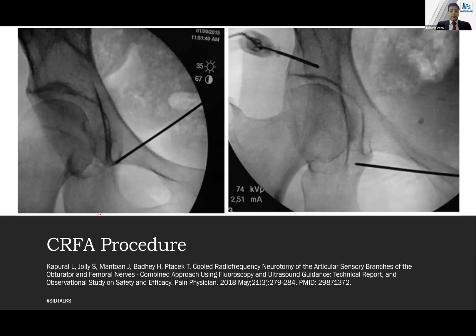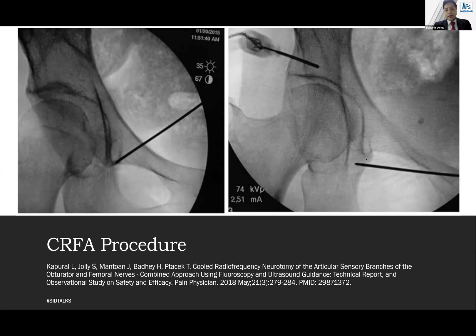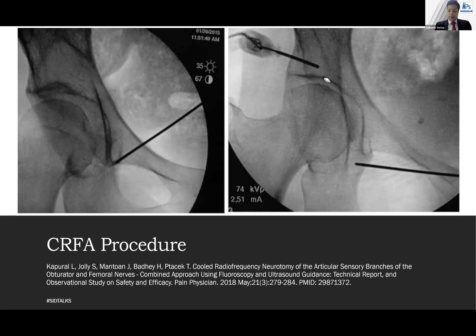For this cold radiofrequency procedure, the pictures beautifully show the teardrop appearance and where the needle is placed. If you get a motor stimulation, you can go slightly laterally. The author also targeted a point slightly below and lateral to this, because Coffield and colleagues found that the obturator nerve had rich supply there as well, so that variations could be covered more comprehensively. The point for the femoral branch remains the same as described.